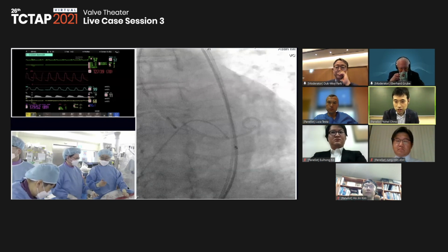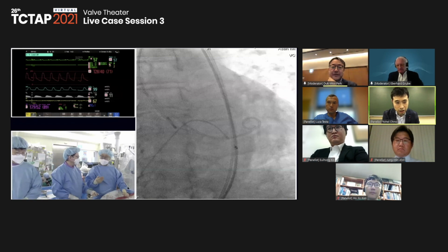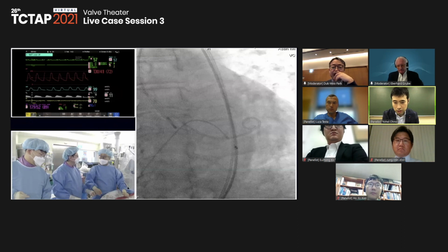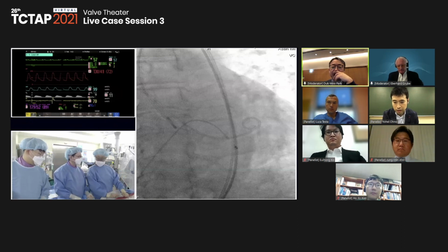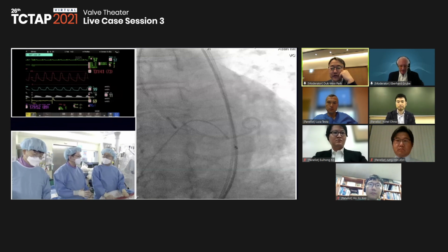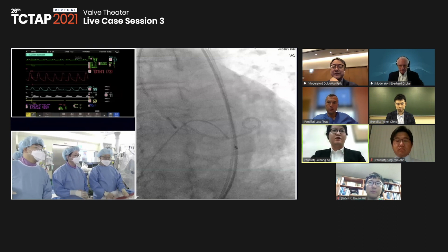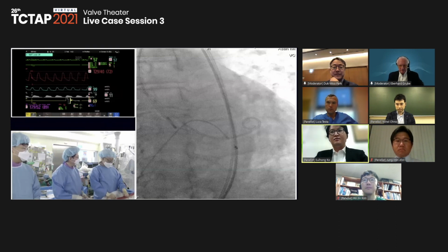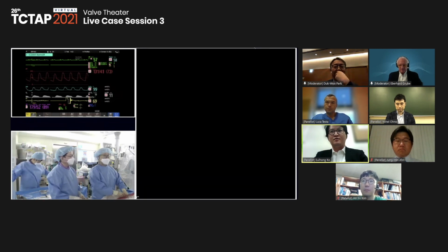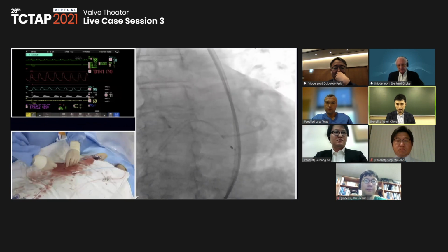Can I ask one question? So the diastolic pressure of the aorta is around 40 and slightly low. So how was his baseline AR? Dr. Go and Euihong, can you comment on that? The status of AR. Thank you for the question. The baseline echo showed just mild aortic regurgitation. And also on the angiogram, just mild AR. And also about the expansion, it is not optimal.